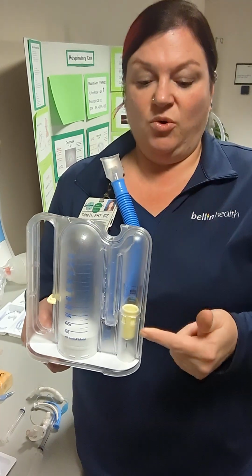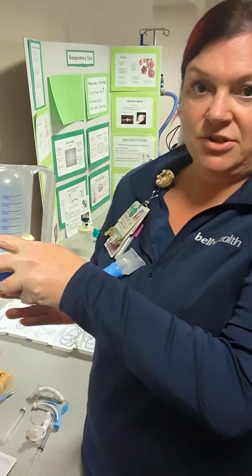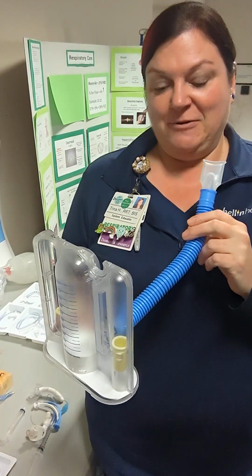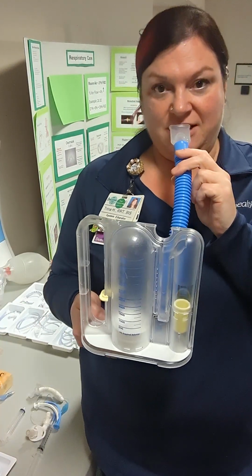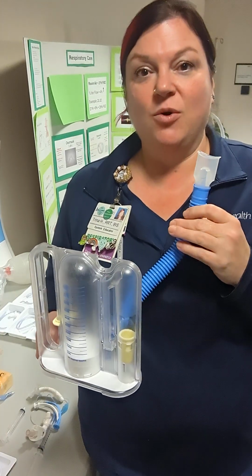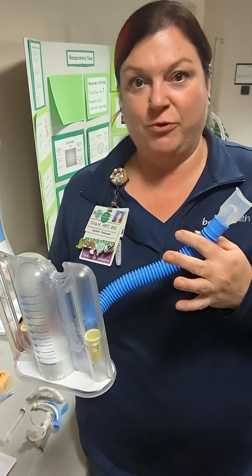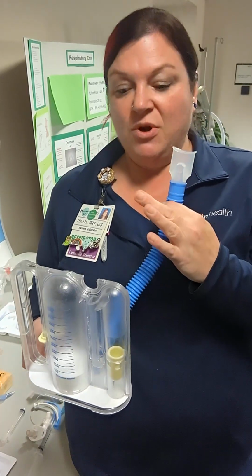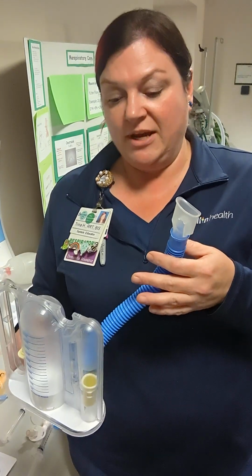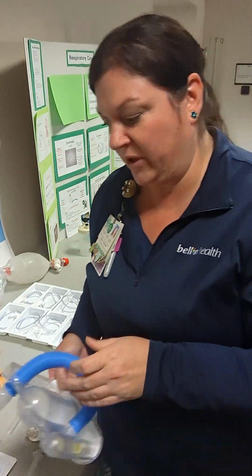And hold. The goal is to just float this little plunger in the good, better, best. It's actually difficult to do. And so if a patient does this, did they achieve their volume? Yes, absolutely. Was it a sufficient breath hold to do any kind of expansion therapy over a long period of time? No. So if you're going to have your patient do these, make sure it's slow, deep breaths and that they hold it. And that is going to help over time lead to progressively more compliant lungs.